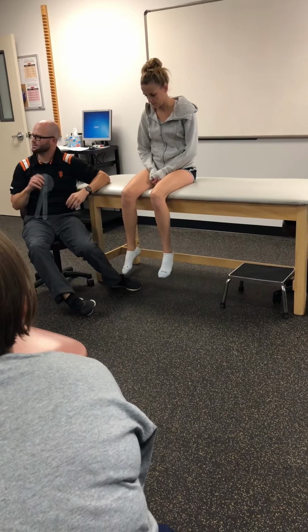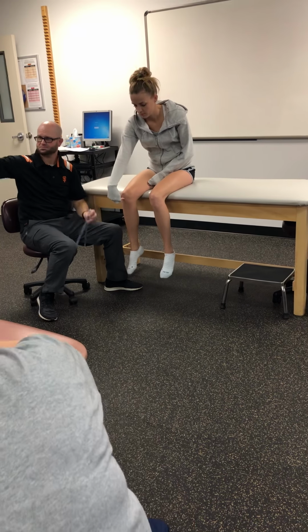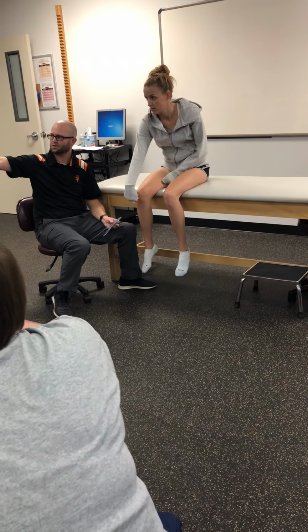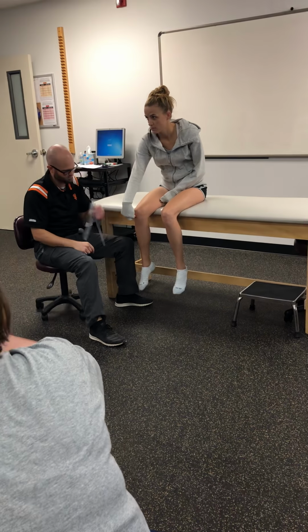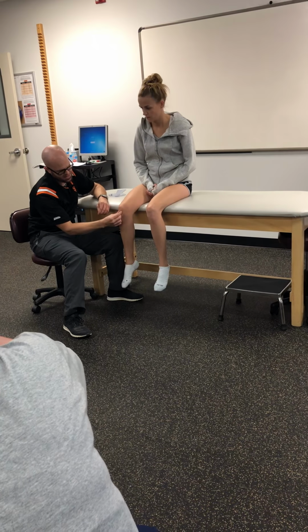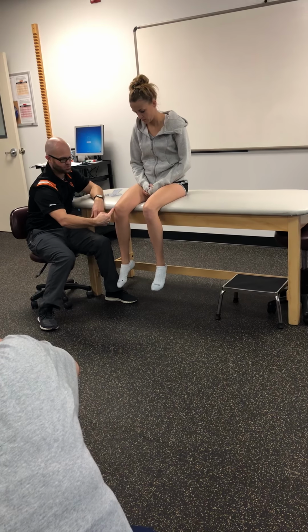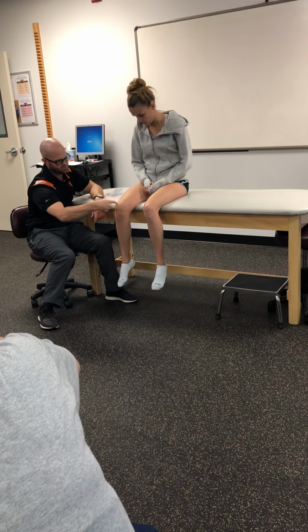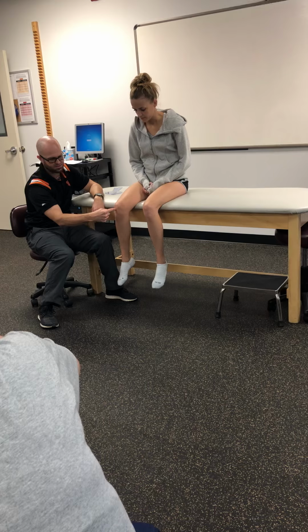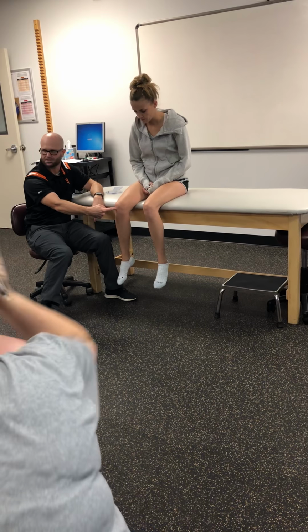Where's our fulcrum going to be? It's the same for both motions. Say it loud, Maka. The anterior aspect of the patella. There we go. So essentially, right there. You can imagine it as if we were to draw a line straight down the femur, and it pokes out the end of the knee. It'd go through right about there at the patella. Okay, that's going to be our fulcrum.